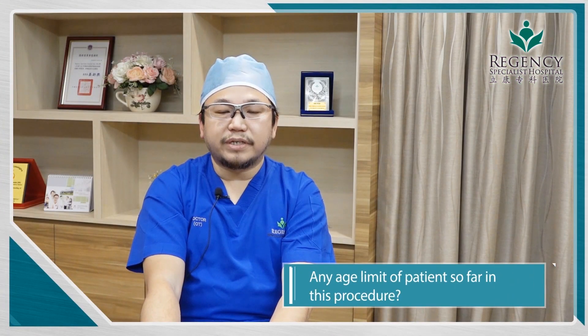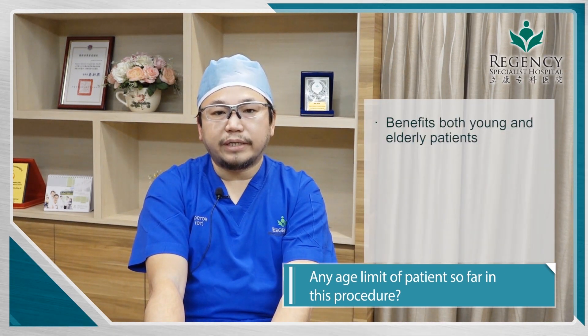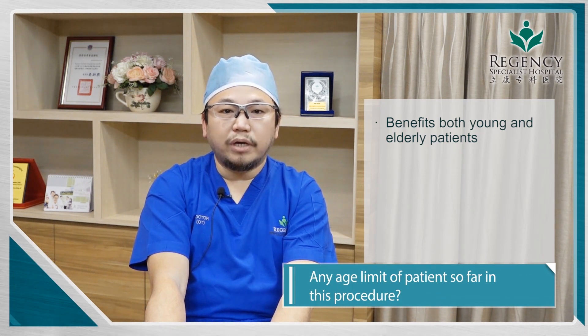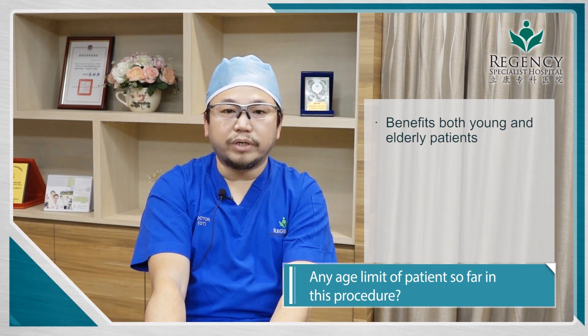Minimal invasive discectomy is not only beneficial for the young age group. In fact, for the elderly, it actually helps much more than the conventional way. When we do the minimal invasive approach, we are not going to destabilize the spinal structures, as we are not moving as much of the bony structure.